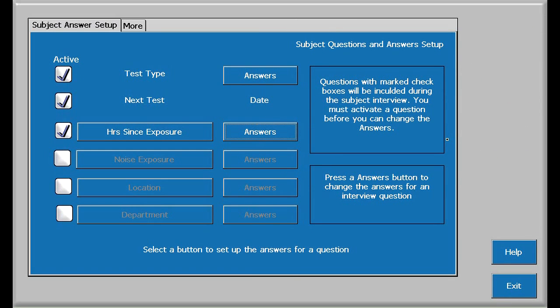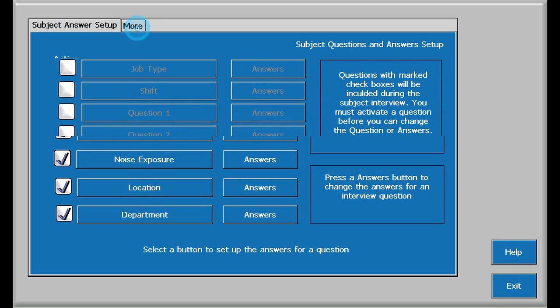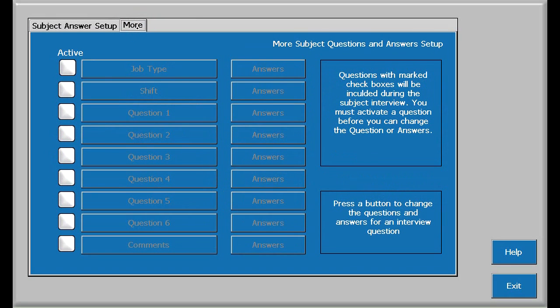So, for the third Q&A, there are two possible actions you can perform. One, select or not to select, and two, enter or modify both the question and the possible answers. For illustration purposes, let's select all Q&As on this screen, and move to the second screen by touching more tab at the top, and checking the first three questions and answers.